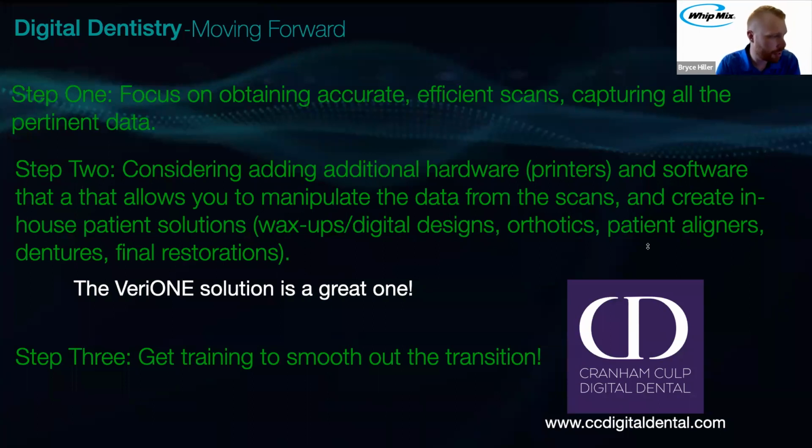The first one is, how do you scan the bite if the patient is edentulous in the upper and a couple of remaining teeth in the lower arch? It's a great question. So is that if it's edentulous, edentulous upper and then a few remaining teeth. So like anything, if you don't have anything in the mouth to occlude against, you're going to have to get something in the mouth. So that might be that you have to do a scan or a traditional impression and get a record base.